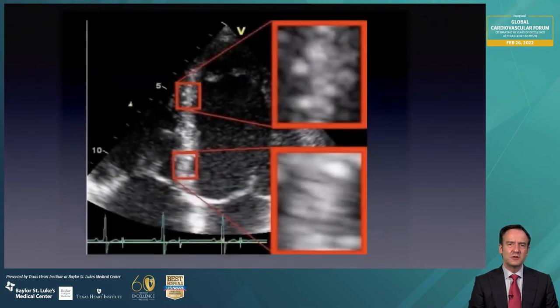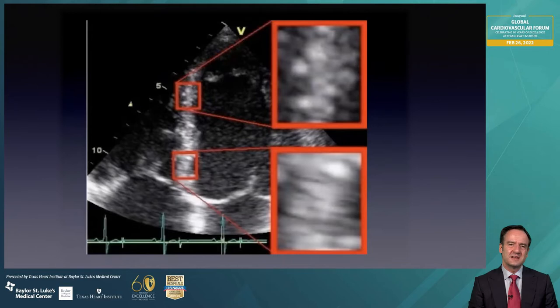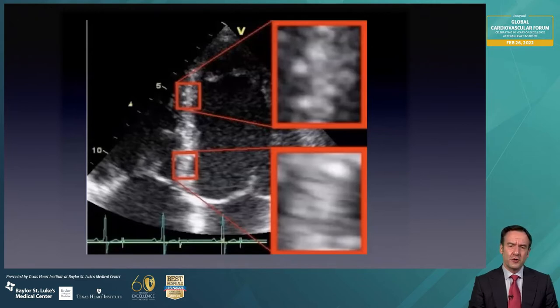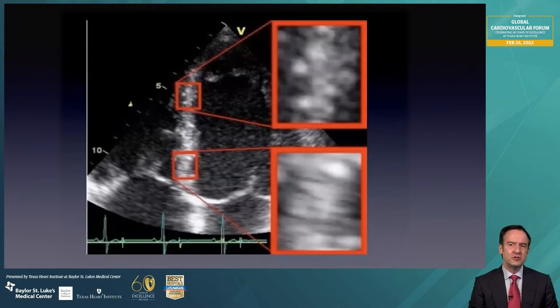In terms of the technique we use, it's called speckle tracking — because that's exactly what it does: it tracks the speckles during the cardiac cycle. Using the example in the right upper panel, you can appreciate two speckles. If you follow these two speckles throughout the cardiac cycle, and the two speckles are coming close together, it means that segment is actually having meaningful deformation and not just movement.